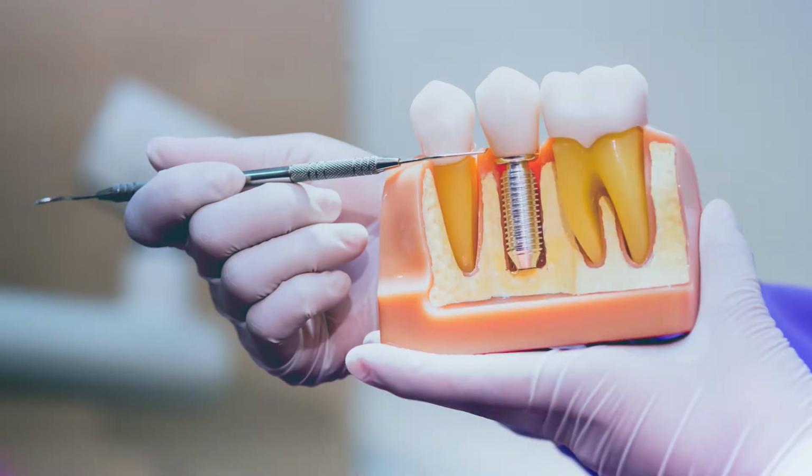Okay, so what typically is the main reason that people choose to go with mini implants versus traditional? Yeah, good question. And I think the real reason is cost mostly. And the mini implants, because the surgery is a little different, a lot of times we don't have to do the grafting step where the ridge is a little narrower. It's a simpler surgery. Our cost is probably a third to half of your traditional implant. So the cost is a big deal. That all implants work.